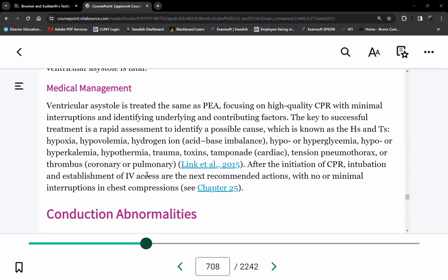Yes, that's why chest compressions only. Okay, very good quality chest compressions, and then it will generate electrical activity. It will generate VTAC or VFib. Then we can defibrillate. Compressions, right? And then they bring the machine and shock them, only if the patient has VFib or VTAC.